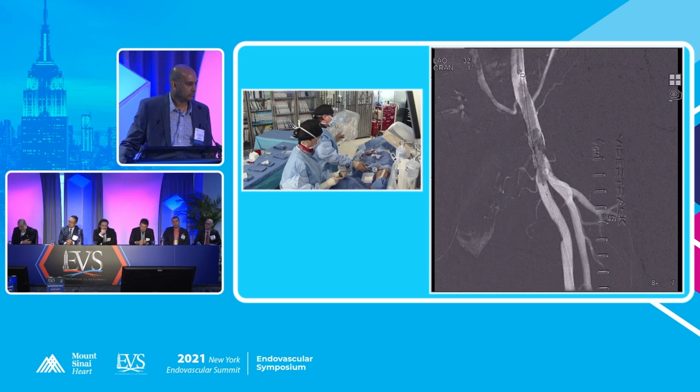But you're right, we're 4 months out from the right common femoral artery with a normal ABI. When we did these ABIs, it was 0.91 or something like that. So it was a durable result, and it looks really good. Let's see, 30 seconds, come on down.